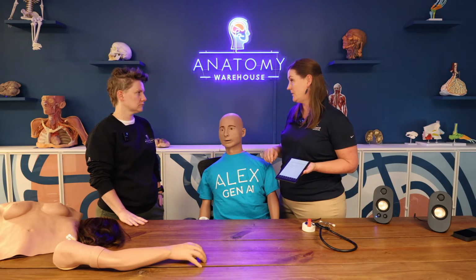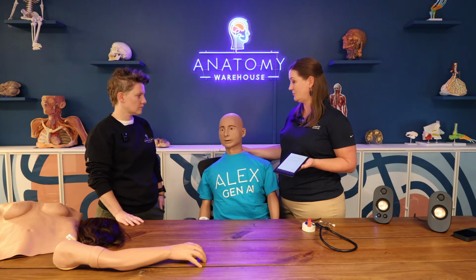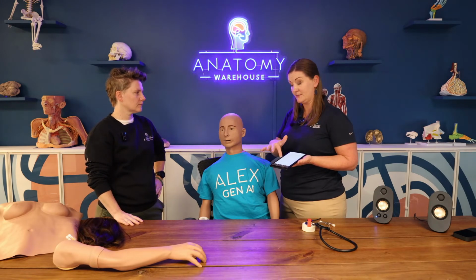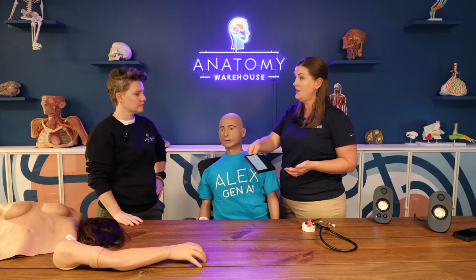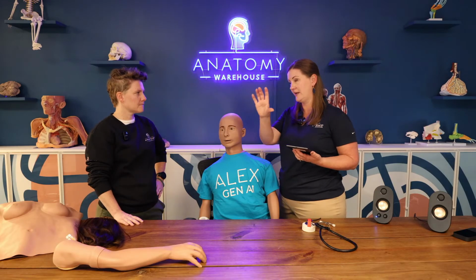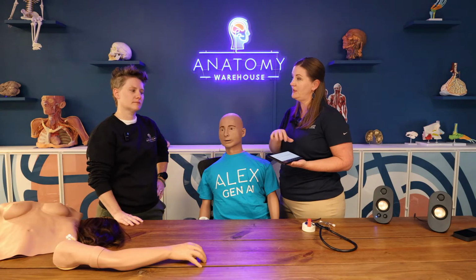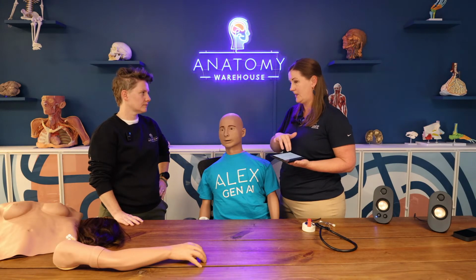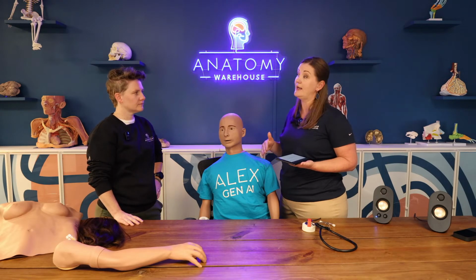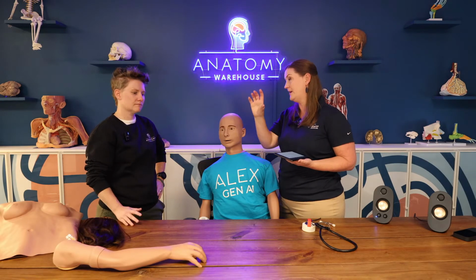Basically what's recorded via the iris camera, and what they're doing physically with the mannequin, is the student interaction. The other thing that the instructors could do with this little tablet as well is populate this as a bedside station. So if they were stating that Alex is in a clinic or a hospital where they might have a vital signs monitor behind them on the wall, they can populate this tablet to be a vital signs station only, or they can have it be a bedside station or a monitor where, if the simulation was driving any kind of CPR activity, they can see the value of their CPR on that bedside station as well.